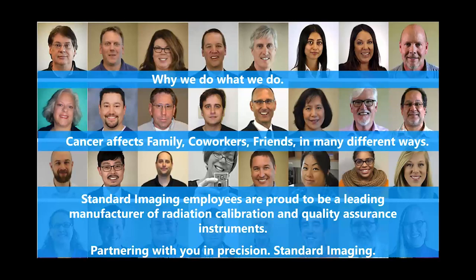So, why do we do what we do? Well, we know that cancer affects families, coworkers, friends in so many different ways, either directly or indirectly. And we're very proud to be a leading QA manufacturer to make sure that those radiation oncology treatments are doing what they're supposed to do in the best way possible. So we want to be your partners in precision for just that.